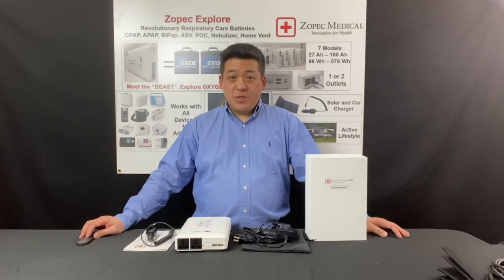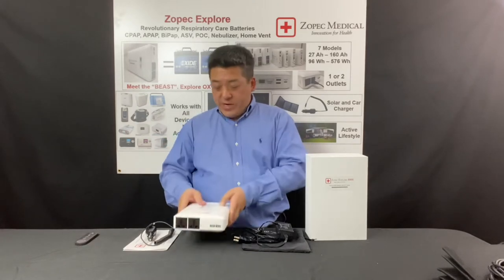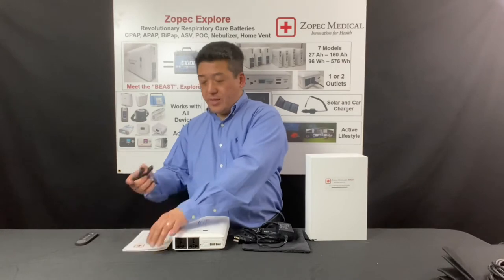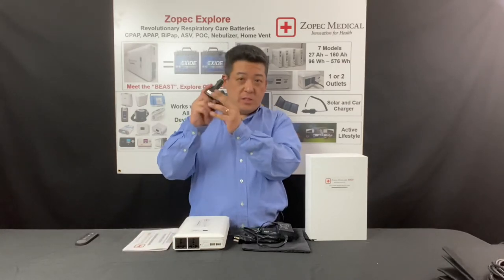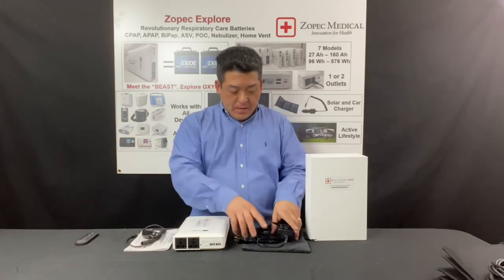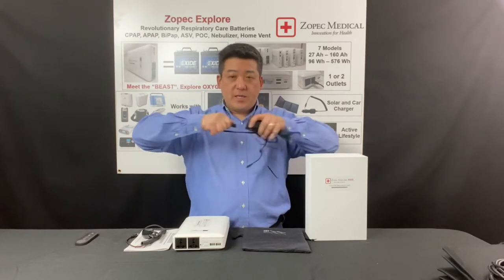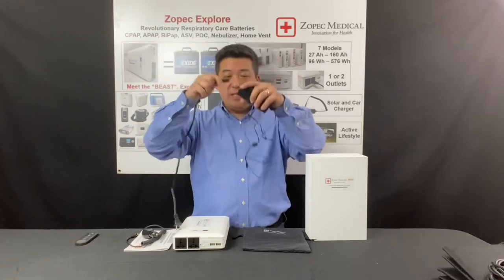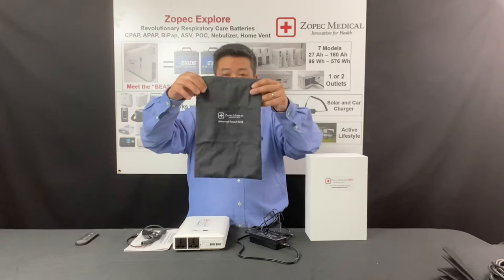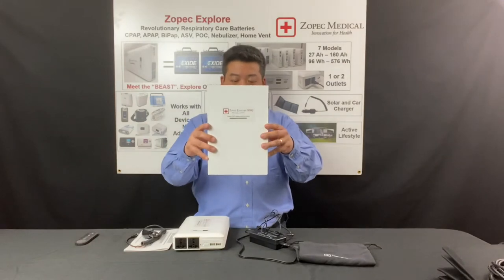When you receive your battery, you should have six different things: the battery, a user manual, a fast car charger — this is only if you bought the 2021 model — a wall charger, which has two components: the plug and the AC adapter, a nice travel pouch, and a storage box that the battery can come with.